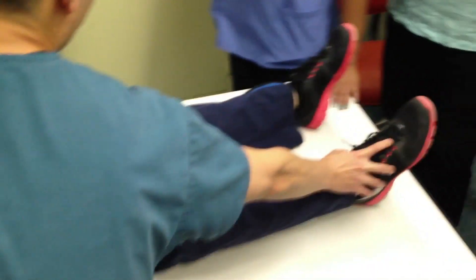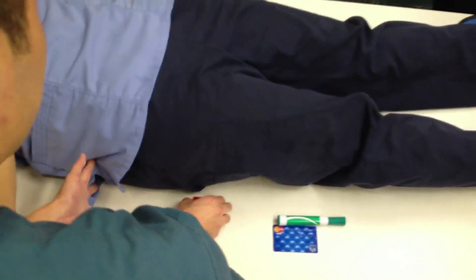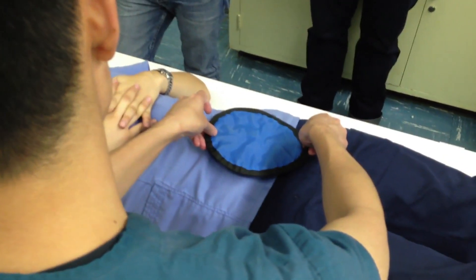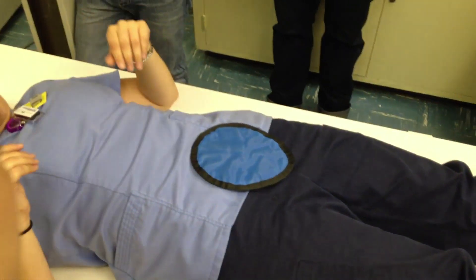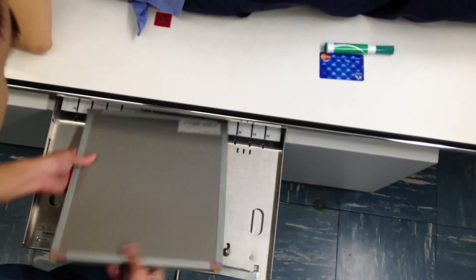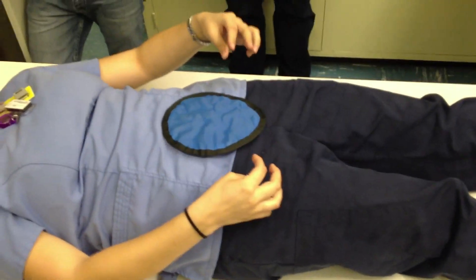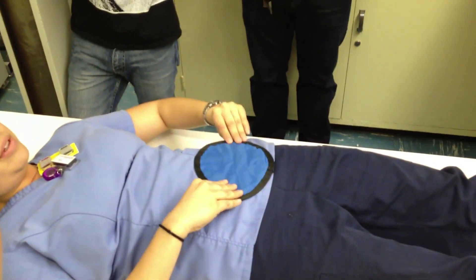Can you invert your feet? Just move them so they rotate inward. You'll learn to do a lot of sign language with patients. For shielding: if you've already done the pelvis, you would shield for this view. Just make sure the shield is on top of their body — it's off to the side, not in the middle. For the lateral, you should have a shield positioned that way. This is how you normally shield — male or female. Since we're just getting this hip area, I'll go sideways with it to protect what needs protecting.